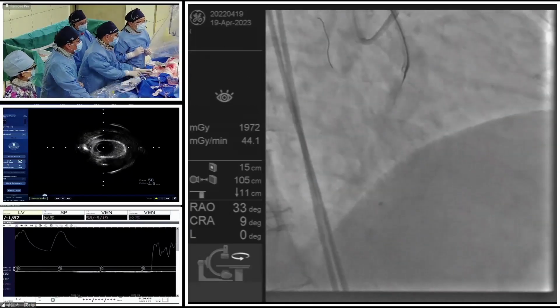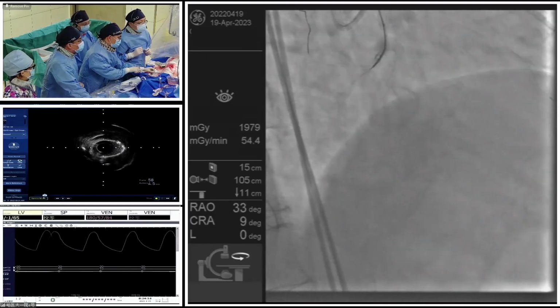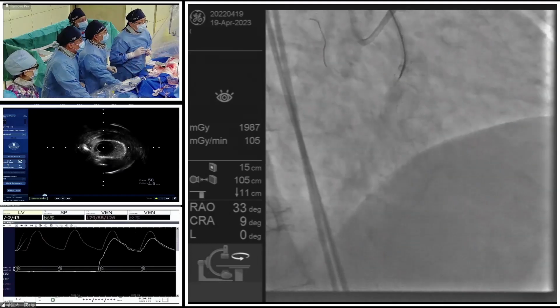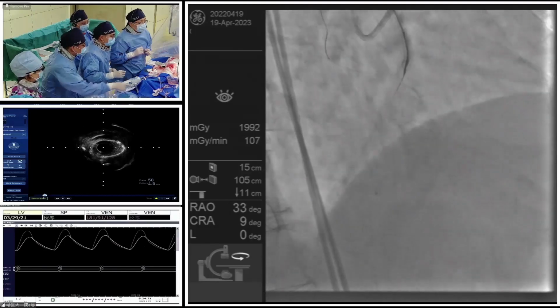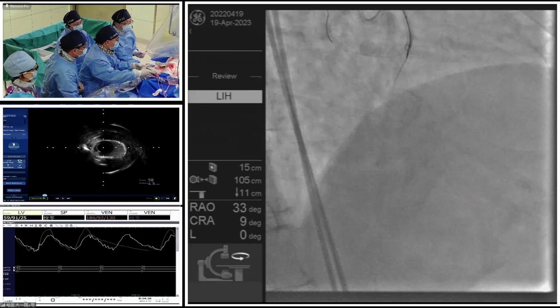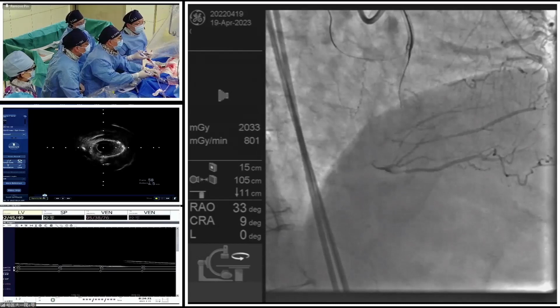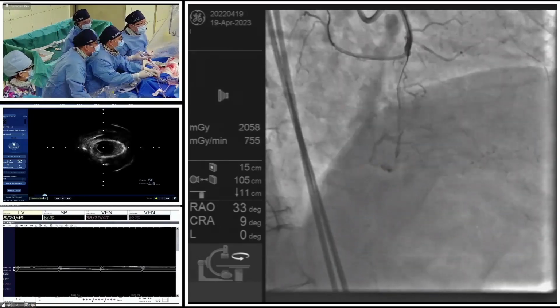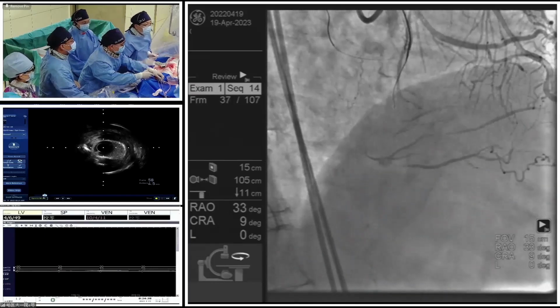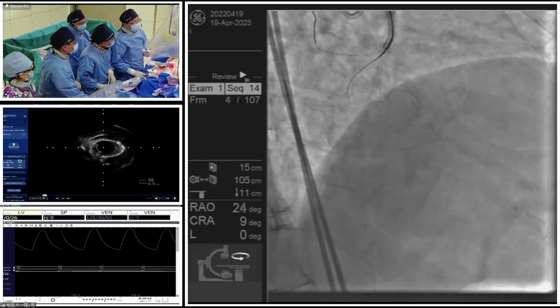We combine CT angiography to make an analysis of the functional evaluation of the coronary artery, which highly raises the accuracy of the functional test. So I think CT angiography is very important and is popularly used in all hospitals. We should make full use of this information to guide our procedures and even the prognosis of the patient.